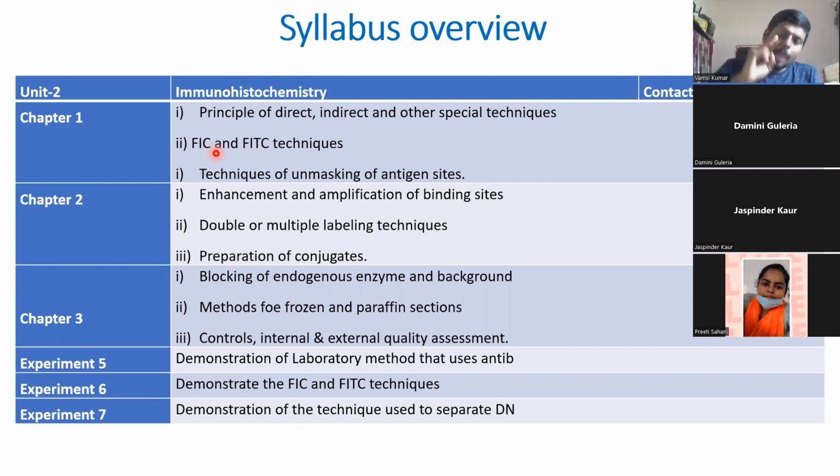Now the problem is, not my reagent peroxidase, but the tissue peroxidase will act. It will react with the antibody and it will give false positive results. There is no PSA antigen, there is no prostate specific antigen, but there is peroxidase.